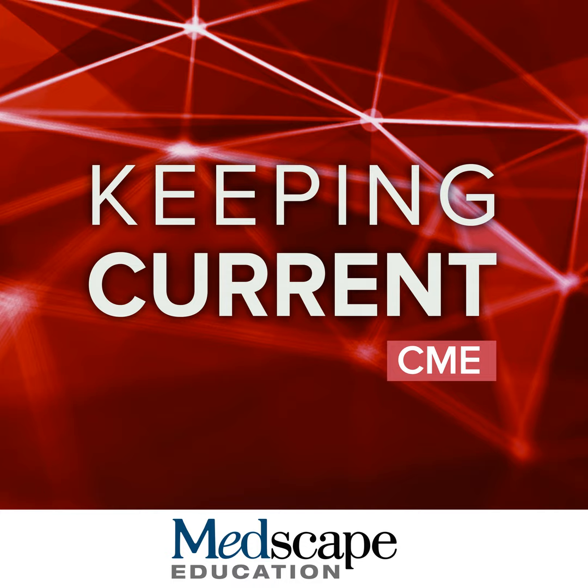There are recommendations by the American Society of Neuroradiology and other national societies against the use of DTI clinically and at the individual level to make the diagnosis of mild traumatic brain injury in individual patients. And there are a number of reasons for that recommendation, and I think that would go beyond the scope of our discussion today.